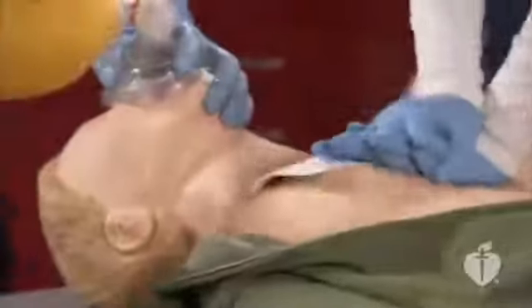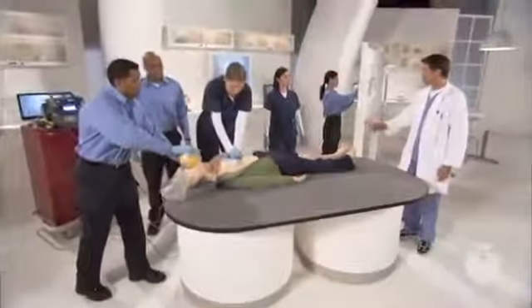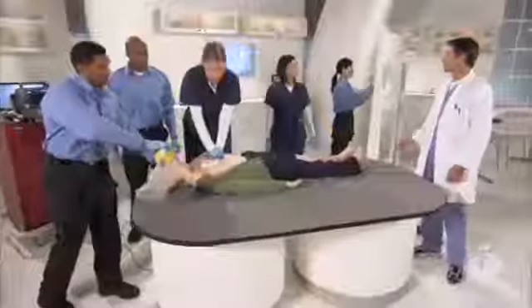We can give amiodarone now? Thanks, Shelley. Dana, please give 300 milligrams of amiodarone. Okay. 300 milligrams of amiodarone given. And the IO is flushed. We've given 3 shocks. After the second shock, we administered 1 milligram of epinephrine, and we've just given 300 milligrams of amiodarone. Our next drug will be vasopressin. Dana, please prepare 40 units of vasopressin. Drawing 40 units of vasopressin.